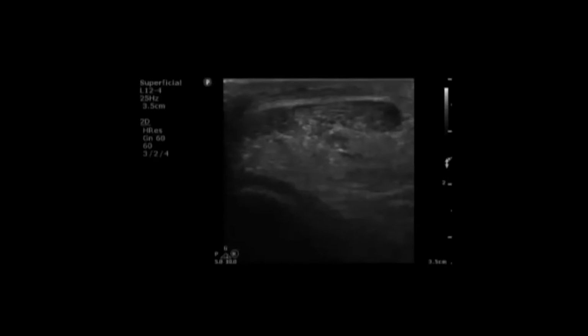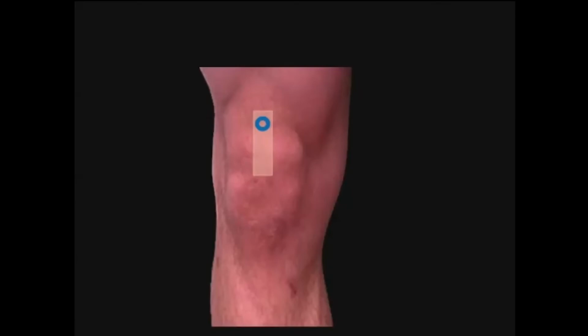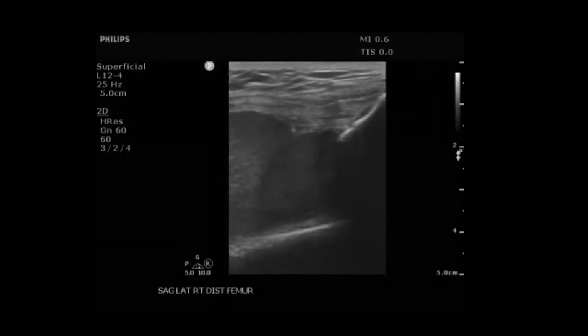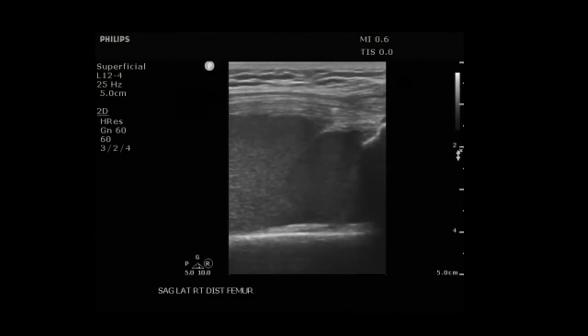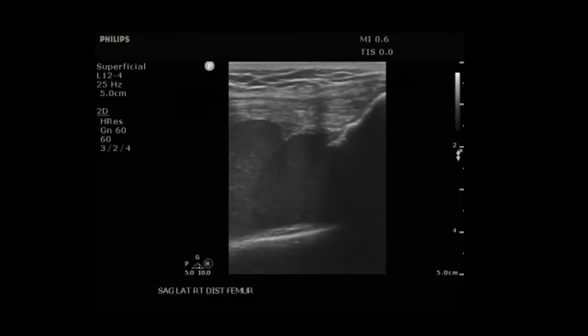So even a pretty subtle fracture you can find. And this is another patient who came in with knee pain after falling on their patella. They had some edema, very tender patella, looked a little strange. And we started to scan, and the patella is on the right side of the image. So that's inferior, and there's a large hematoma above it.